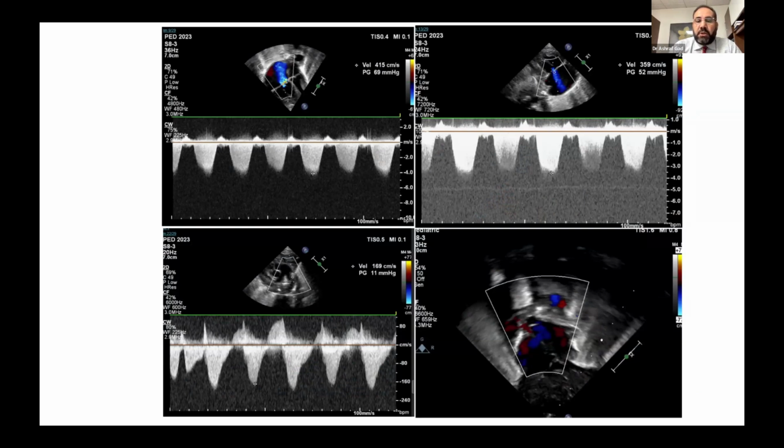right ventricular systolic pressure. As we all know, tricuspid regurgitation is not available all the time, and you may miss it in one third of the cases. You try to look for it in different views and with different tricks. You can also look in the parasternal long axis, and the baby has a similar TR jet. This baby also had predominantly right to left shunting through the PDA, as well as predominantly right to left shunting through the PFO.